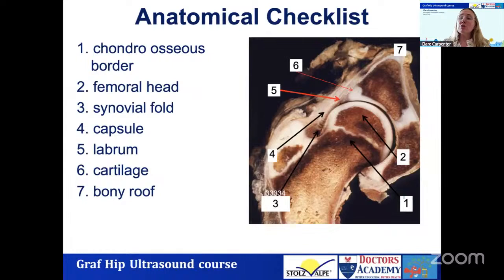So Graf and teaching Graf hip ultrasound is very didactic. We make sure that we adhere to all the checklists so that we get reproducible ultrasounds each time. Because unless you get a reproducible ultrasound, how do you make any judgments on what your treatment is doing and how that hip is improving or not with your treatment modality?